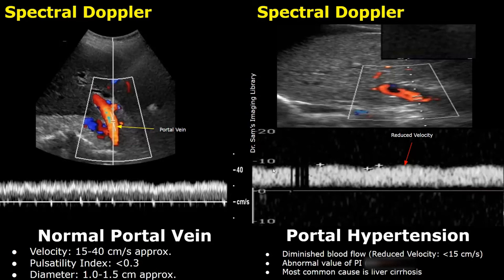In cases of portal hypertension, the blood flow velocity can be reduced — it will be less than 15 centimeters per second, and in this case it is less than 10 centimeters per second. The value of the pulsatility index will also be abnormal. We can also see a thrombus within the portal vein, which can also cause portal hypertension.